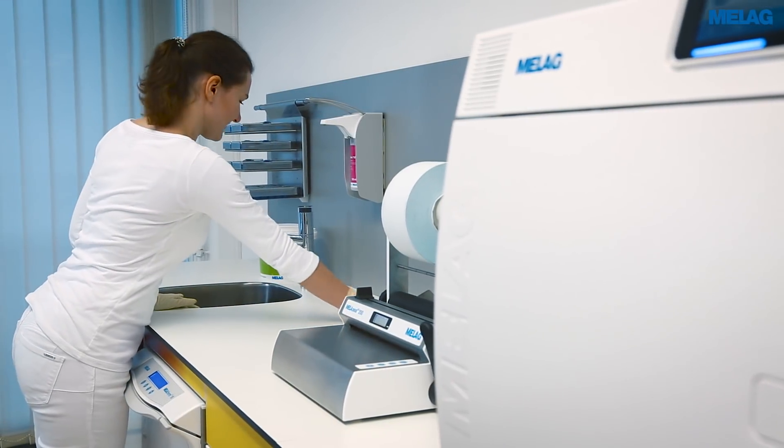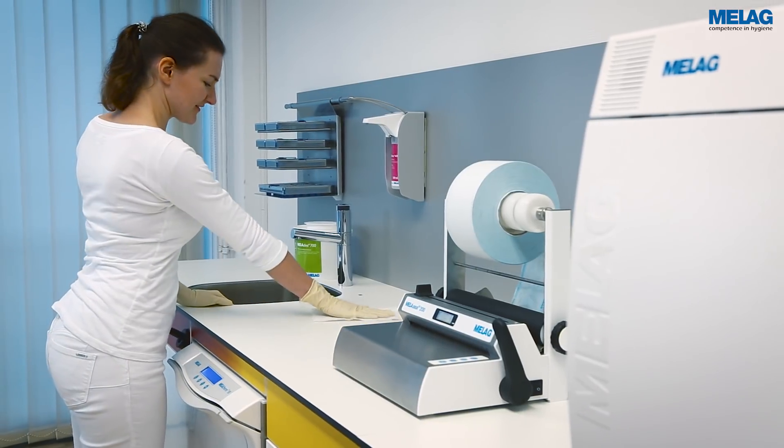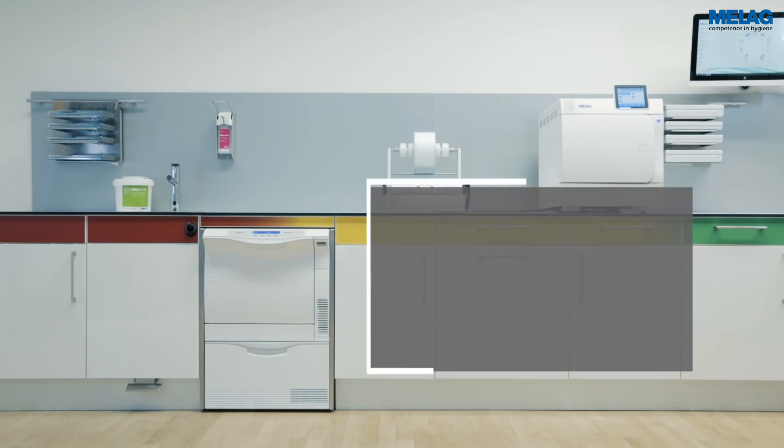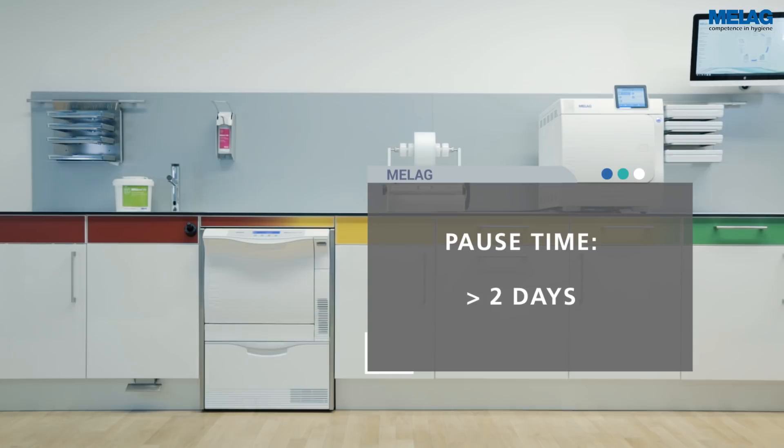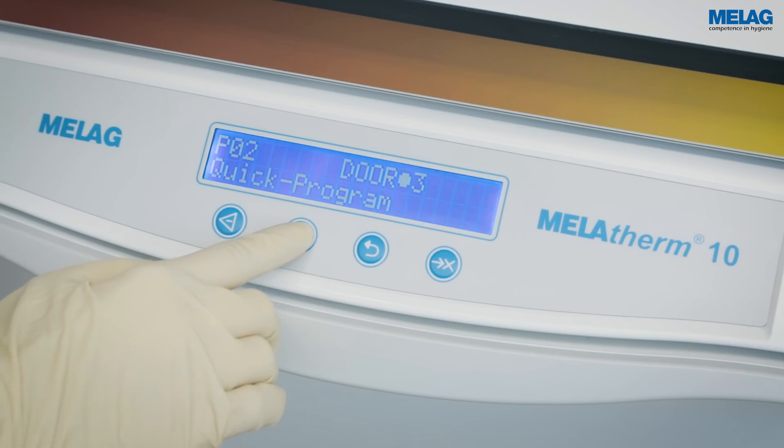The high-performance MELAtherm 10 allows instrument decontamination without interruption. If the device is not used for two days or longer, it is necessary to perform the rinse program twice before performing instrument decontamination.